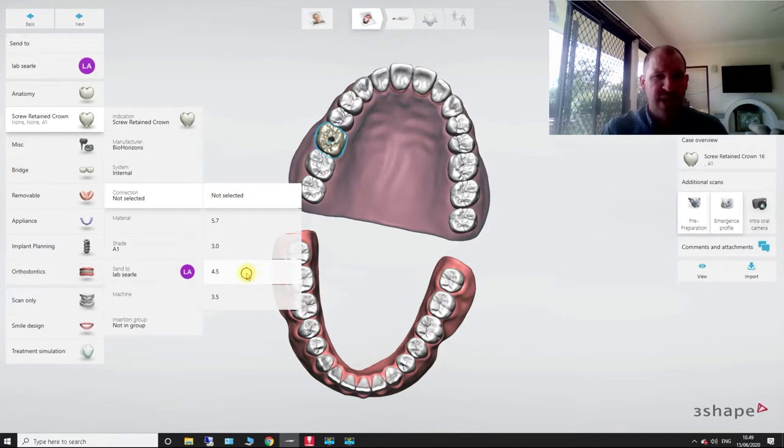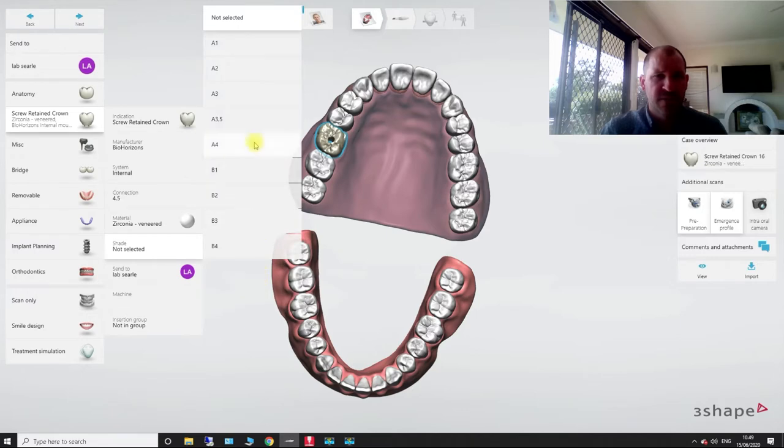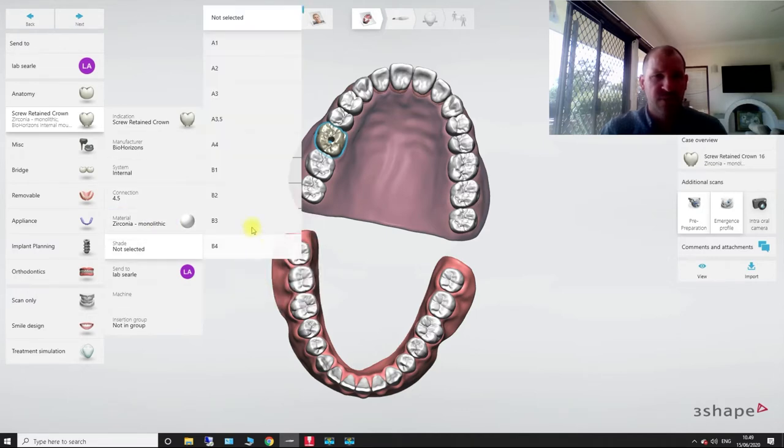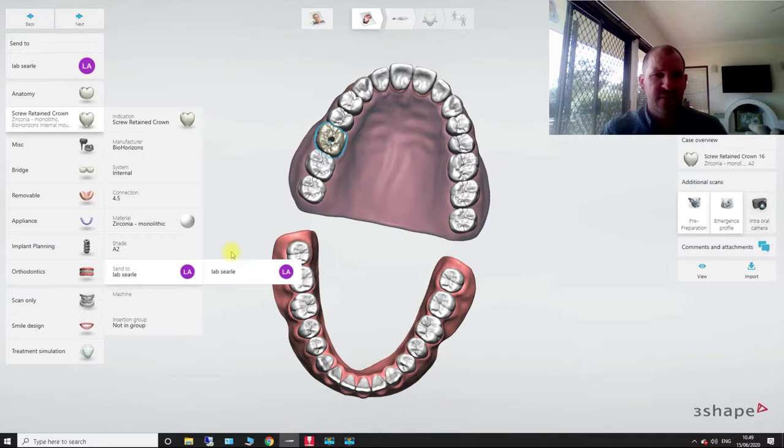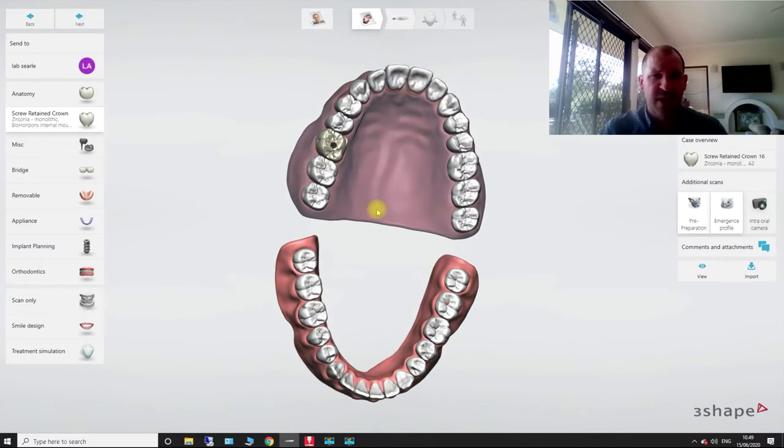We'll choose our size. So we're going to put our material in. So let's go zirconia monolithic, A2, the lab that we're sending to, and it's not in the group. So that's a single implant.